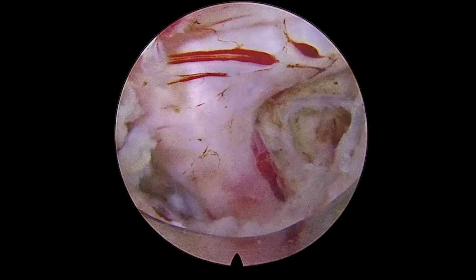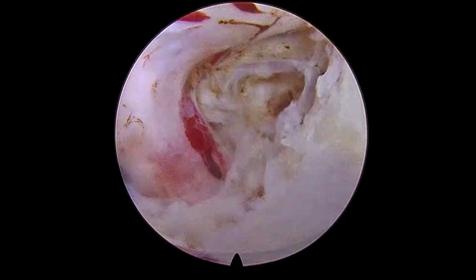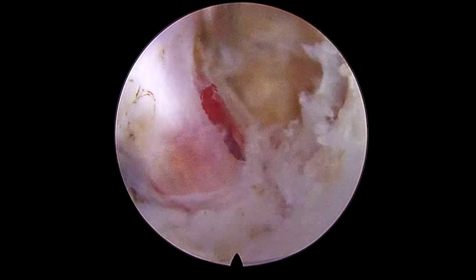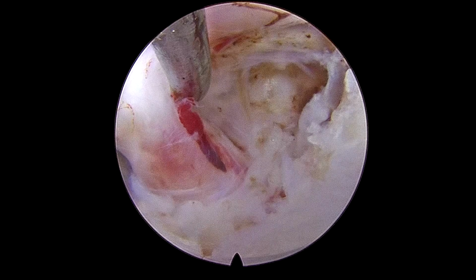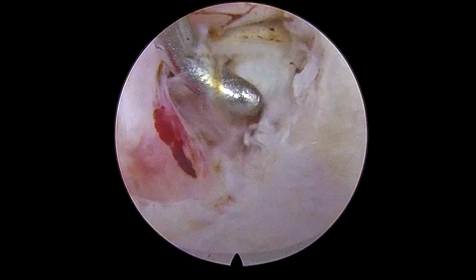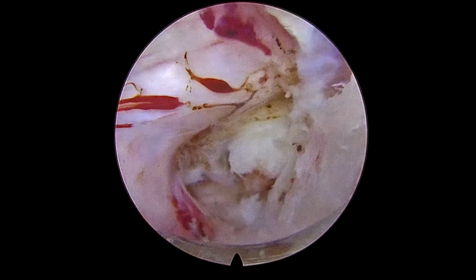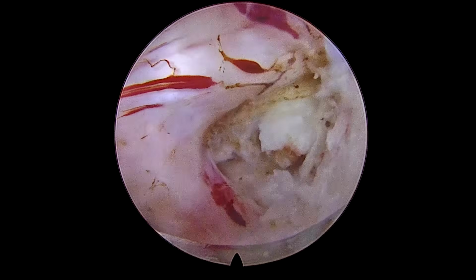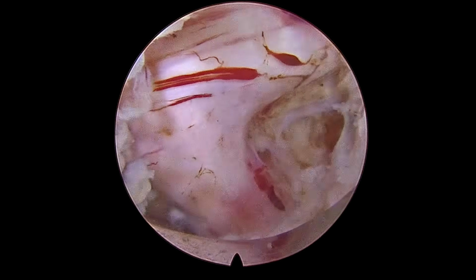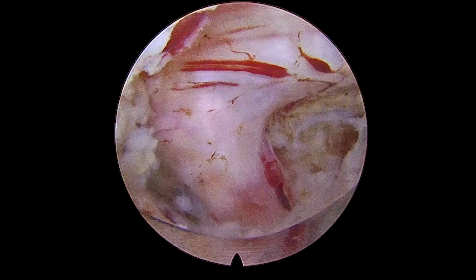You will realize gradually the nerve will become lax. So now I am trying to get fragments from underneath the nerve root. This patient had multiple short fragments.